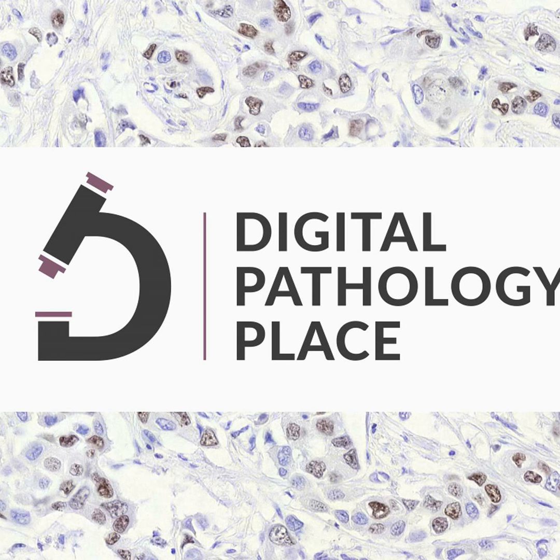Now, at the other end, more accurate with microscopy were two of the breast in situ carcinoma categories, both resections and biopsies. And when I say more accurate with microscopy, again, not much, like 8%. So if the entire study were 2,000 cases like that, I suppose it would have failed, but we don't know because the study was underpowered with that sample type. But what that tells you is that that's a type that's intrinsically challenging with microscopy, right?